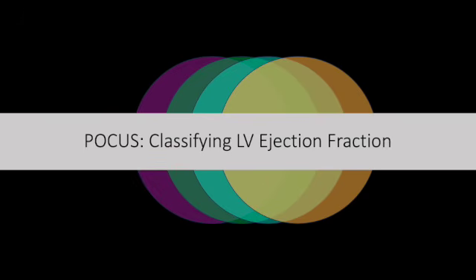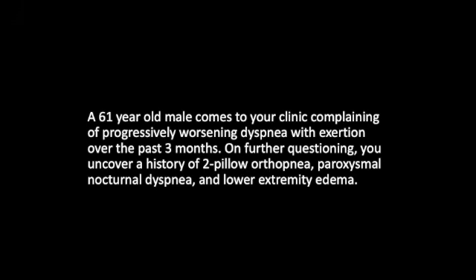In this lesson, we're going to use point-of-care ultrasound to help us identify whether or not the left ventricular ejection fraction is normal, or greater than 50 to 60%, or abnormal, meaning less than 50%. Let's start with a case.